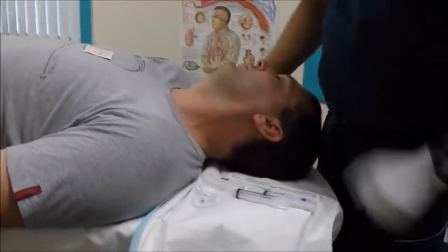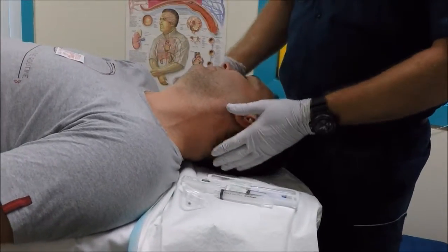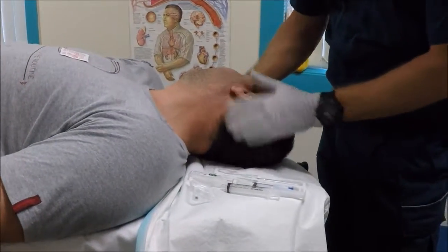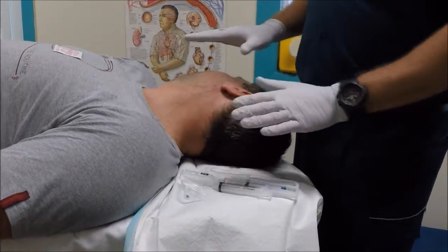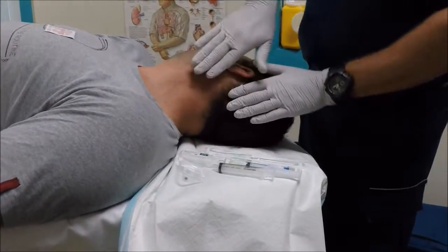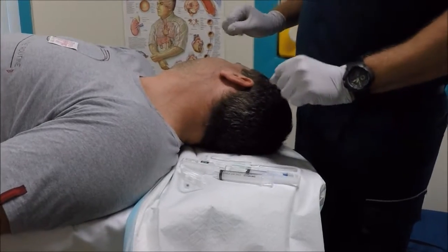Obviously we can't tourniquet this vein because we don't want to cut off cerebral blood flow for a start. So we rotate the patient's neck between 45 and 60 degrees to the side. Obviously if there are C-spine precautions, this is not an option. It's contraindicated in C-spine precautions because we don't want to tilt the neck. You still can cannulate the EJ vein with C-spine precautions, we just don't rotate the head.